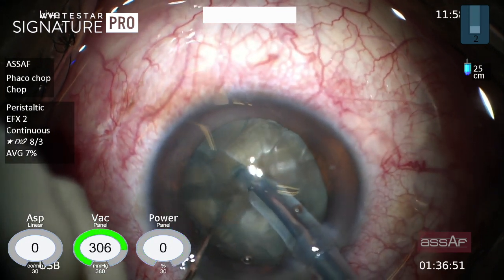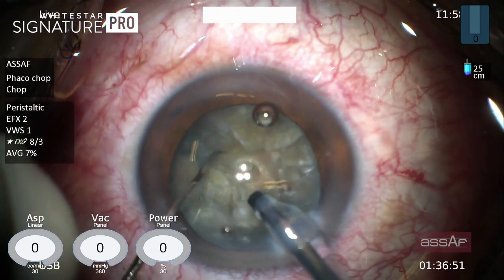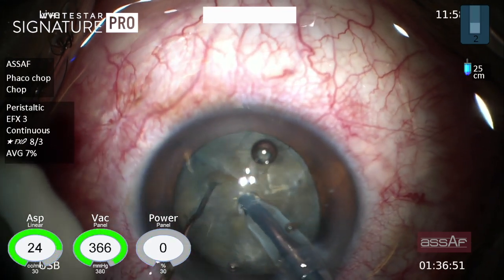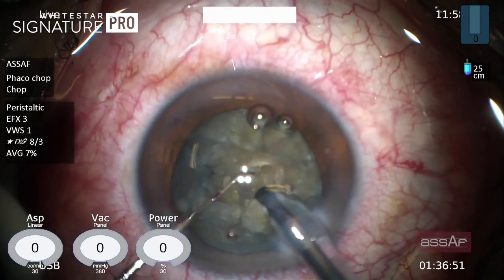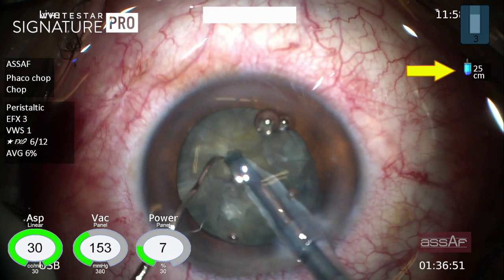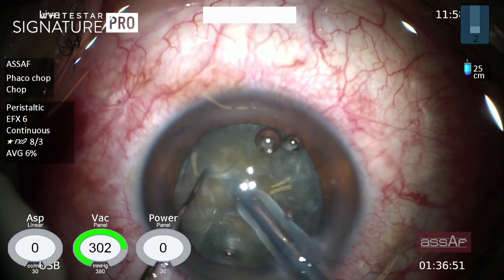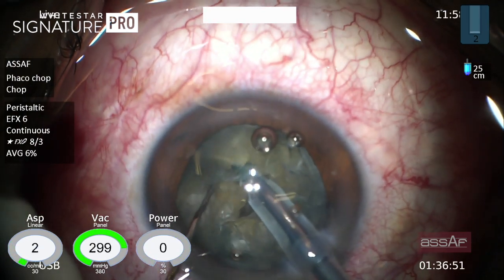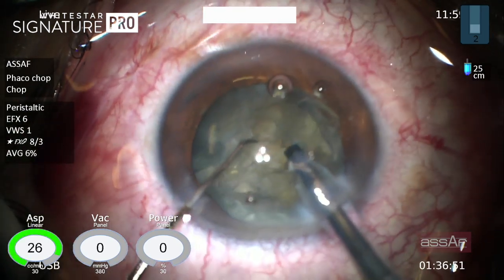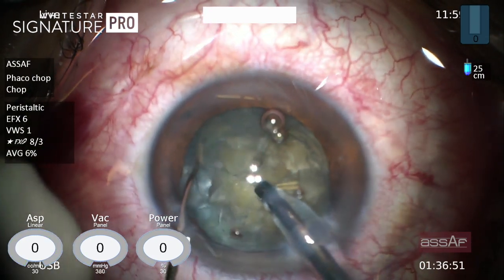Now applying the quick chop technique — I believe vertical chopping can divide the nucleus without inducing too much stress on the weak zonules, yet I don't insist on complete separation of the nuclear fragments because it might jeopardize the already weakened posterior capsule. I kept the bottle height very low at 25 centimeters above the patient's eye, because increasing the bottle height increases infusion pressure, causing a hyper-deep anterior chamber due to the zonular laxity and lack of vitreous gel in the posterior segment, making the cataract less accessible for chopping with the left hand.